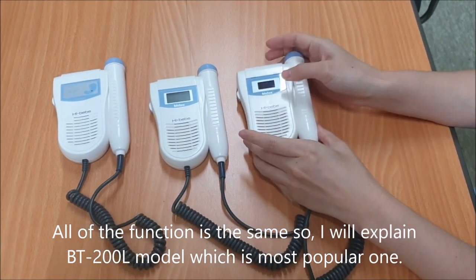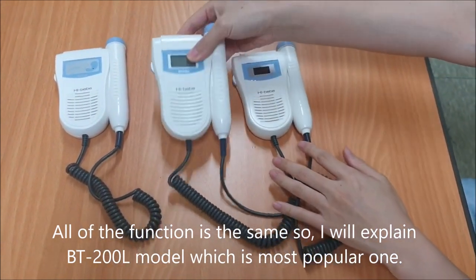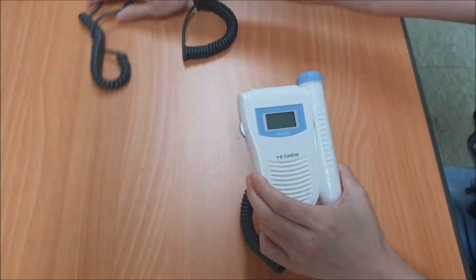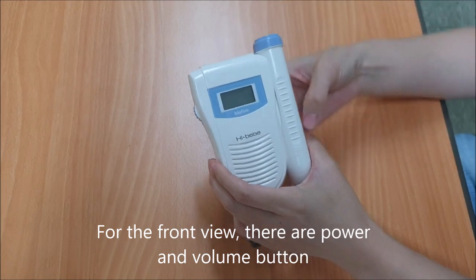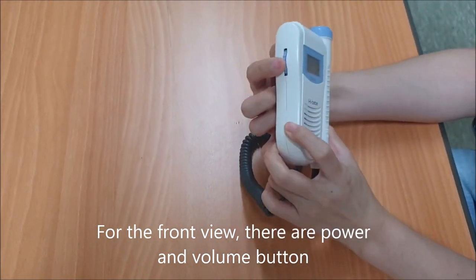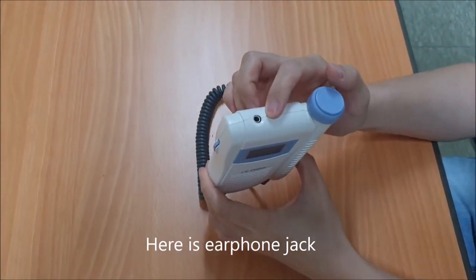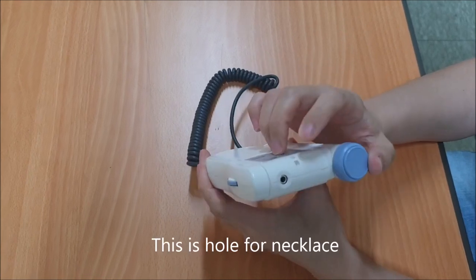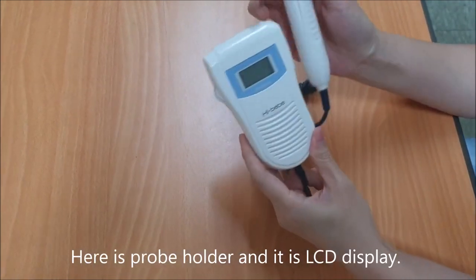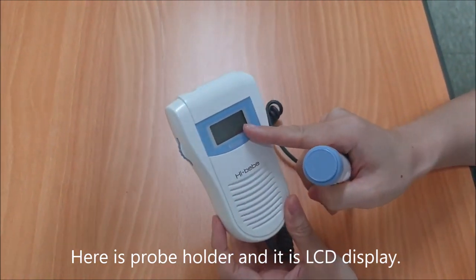All of the functions are the same, so I'll explain the BT-200L model, which is the most popular one. For the front view, there are power and volume buttons here, and here is the earphone jack. This is the hole for a necklace. Here is the probe holder, and this is the LCD display.